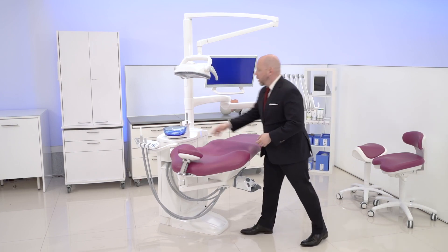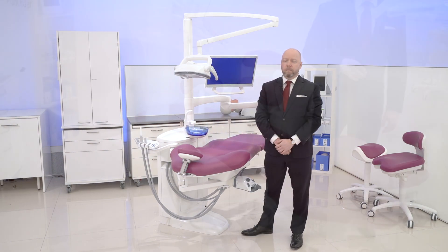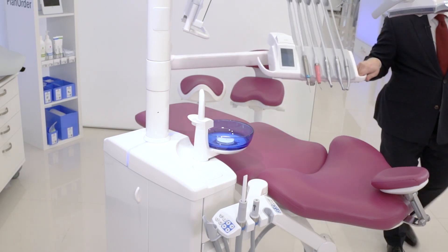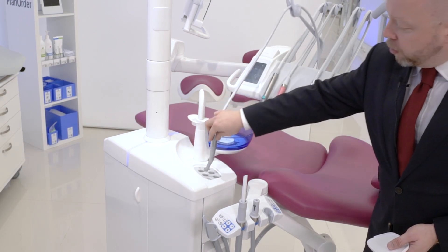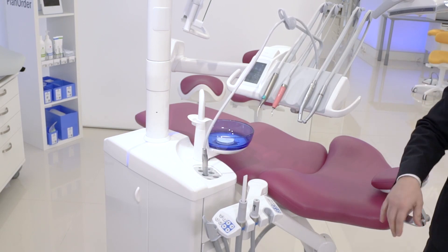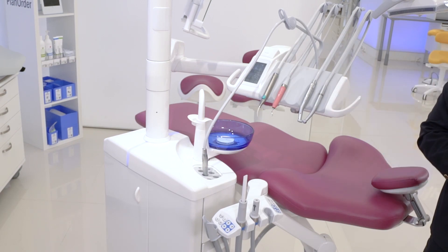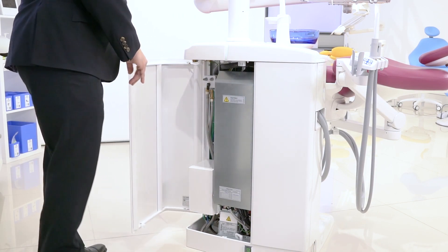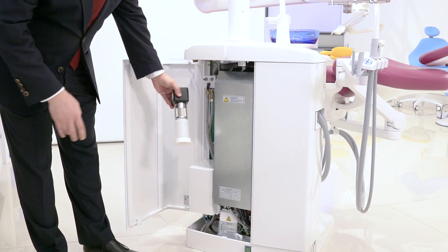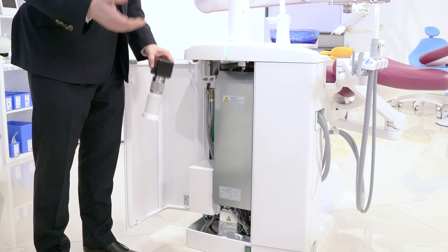The bowl can be removed and you can wash it in a washing machine. For waterline cleaning, we have an integrated flushing holder — great to keep fresh water running through the instruments. The instrument delivery water supply itself is a loop, so no stagnant water is left there. For water treatment, we have different options, from periodical shock treatment as we have here, to continuous chemical or chemical-free treatment, according to user preference.